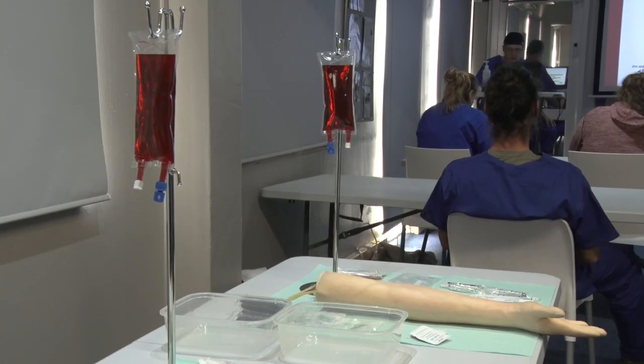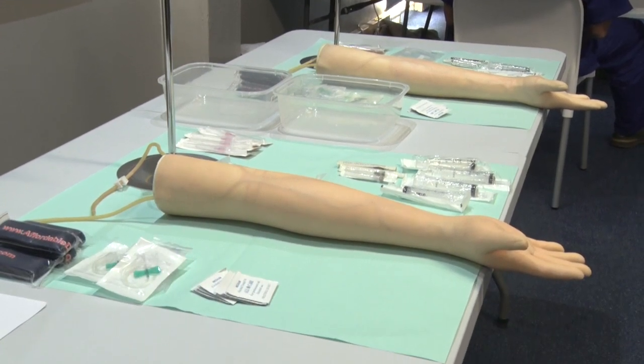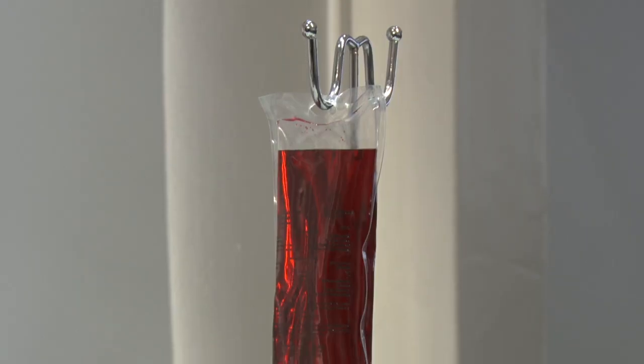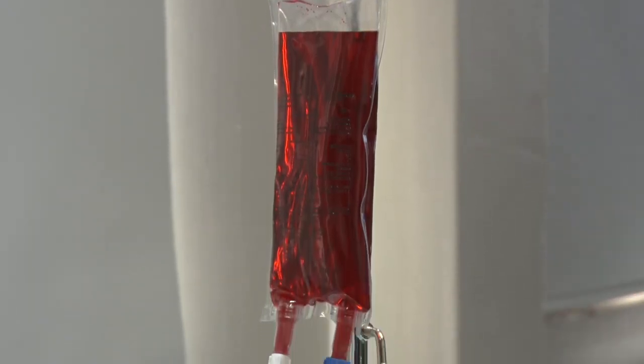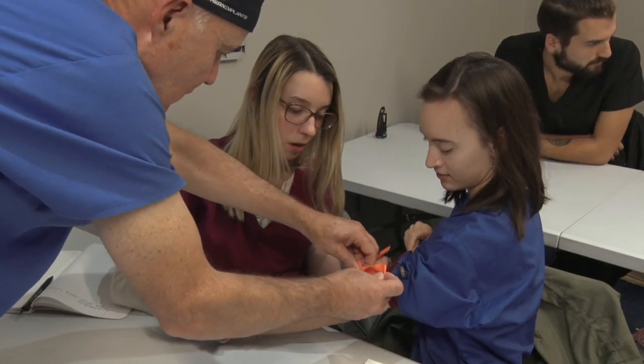Using the Apprentice Doctor resources, instructors can teach the various injection, phlebotomy, IV, and associated skills to most students successfully during a phlebotomy and IV skills workshop. Almost the full spectrum of medical and nursing professionals needs good phlebotomy and IV skills.